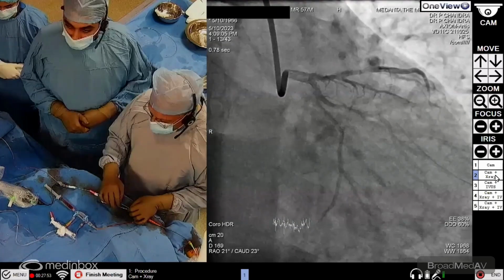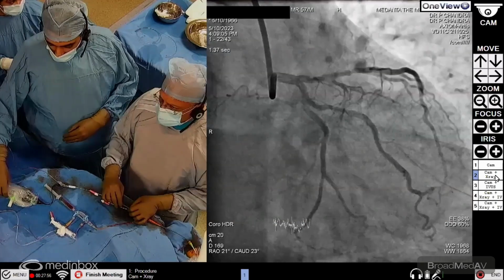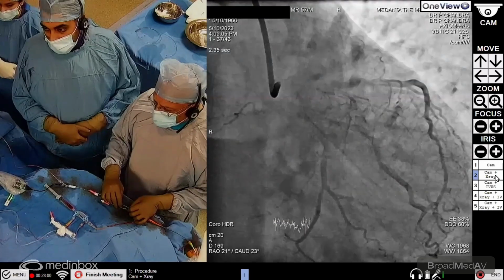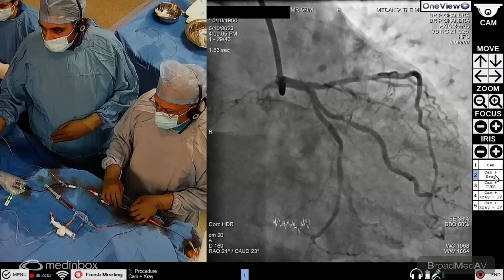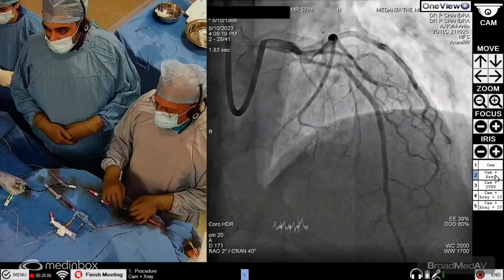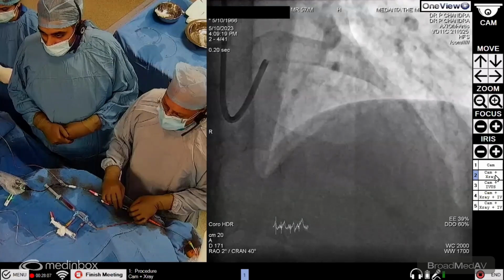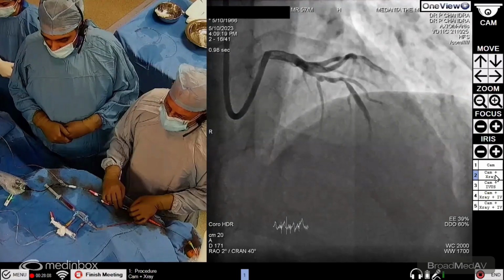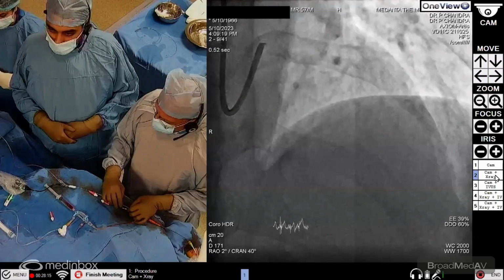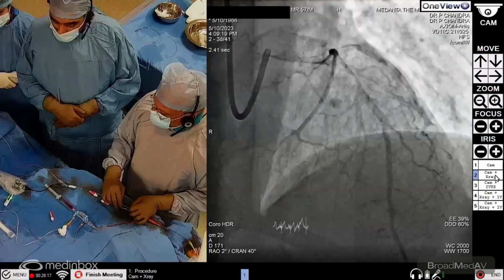So here we have the first angio shot. You can see that the calcification is there, and this artery has a long lesion. So this is a challenging situation. And the second challenge, as he already said, is that antiplatelet therapy will be an issue, especially in the long run or maybe even the midterm. So our strategy here is to first prepare this lesion vessel very well.